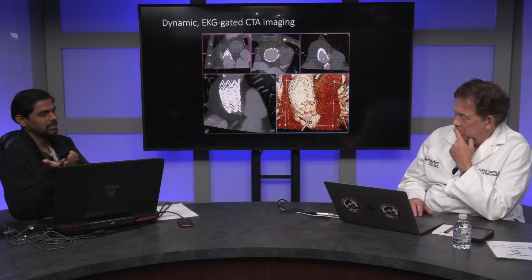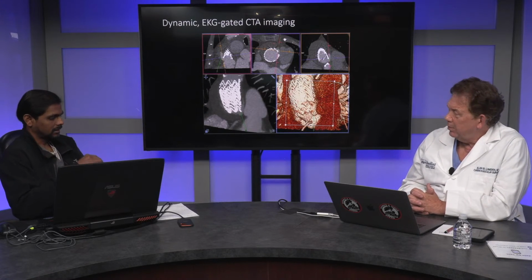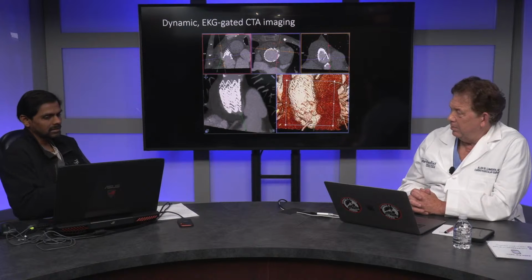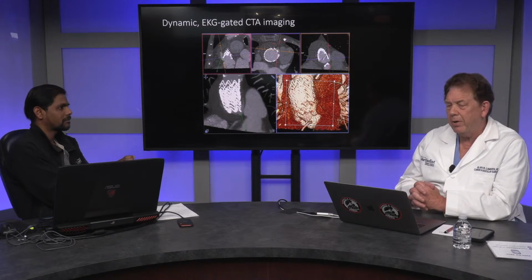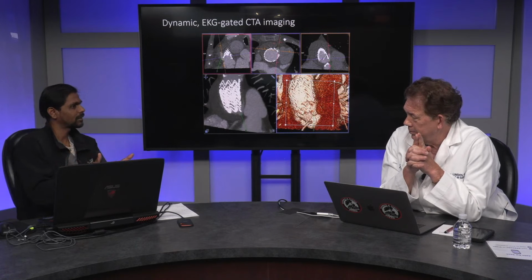Especially with dynamic CT, you saw the actual acquisition. It hardly takes less than a minute. The MR, especially the MR images that you saw, takes on average one hour of image acquisition. So if we come up with the right mixture, where you do a CT and then get the right MR sequence that complements the information from the CT, then we can bring the scan time from 1 hour to maybe 15-20 minutes, which is bearable by most patients.